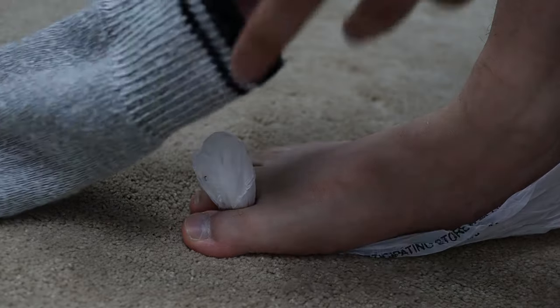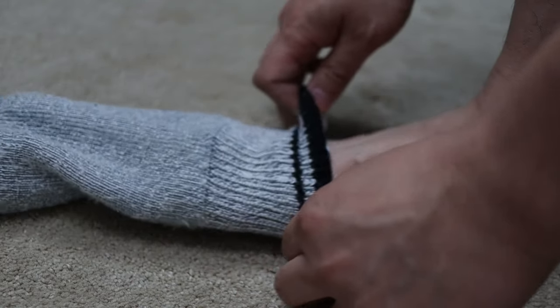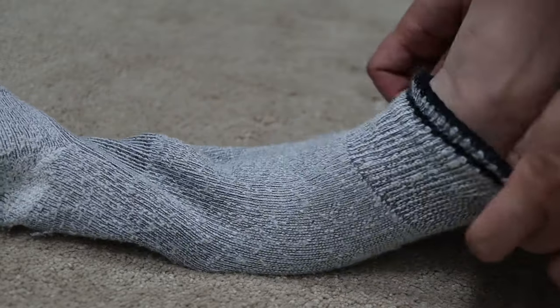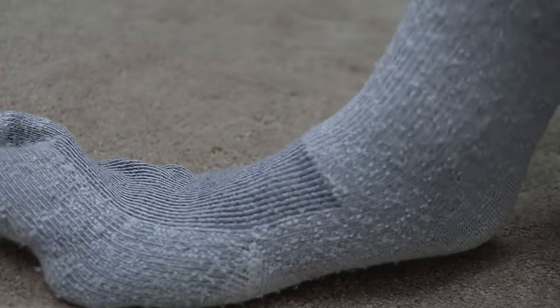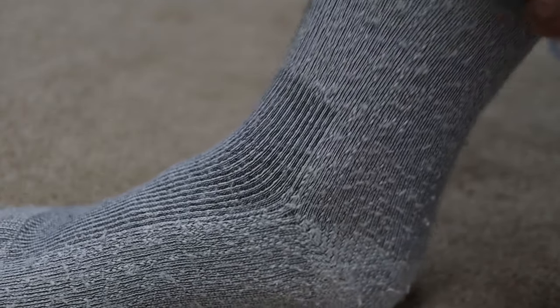Align the compression socks correctly. Make sure that the heel part of the compression socks is on the bottom. Pull the compression stocking on and glide it across the plastic. Working your way from one end to the other, remove all of the wrinkles.